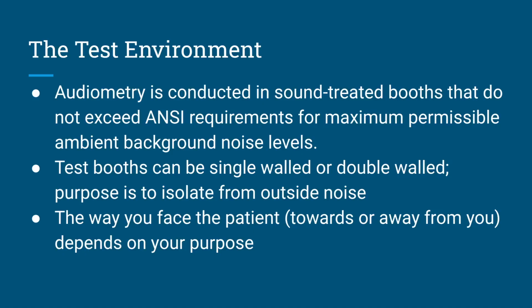And then the way you face the patient, either towards or away from you, depends on your purpose. If you want to face them away from you, that's so they don't get visual cues from you pressing the button on the audiometer. If you want to face them towards you, it's usually during speech audiometry, so you can read their lips when they're responding to word recognition testing. A lot of times a 45-degree angle perpendicular to the tester is a good compromise in general.